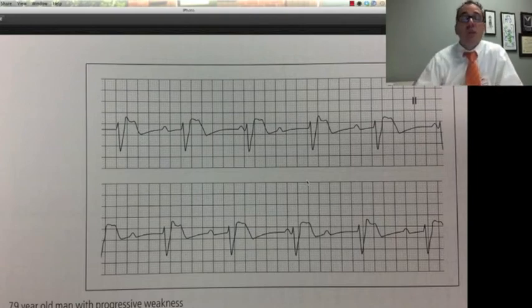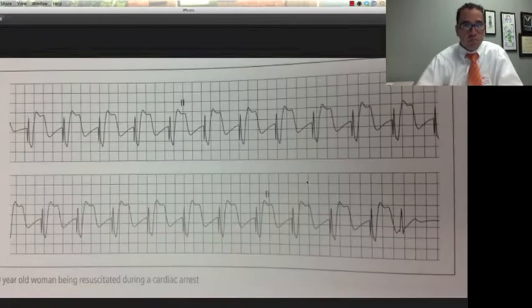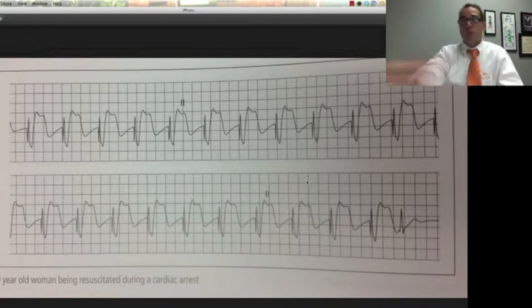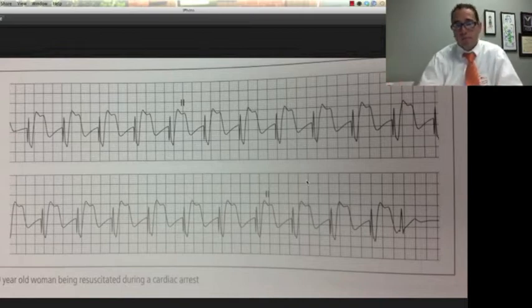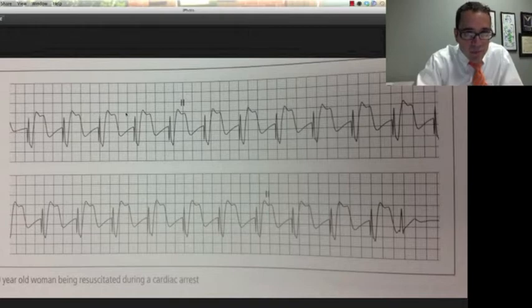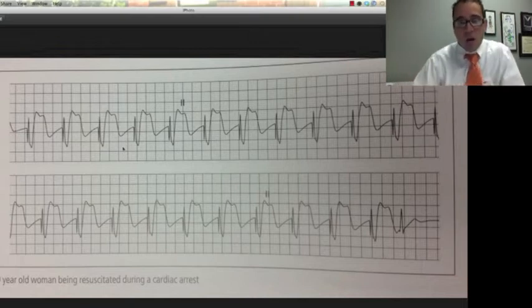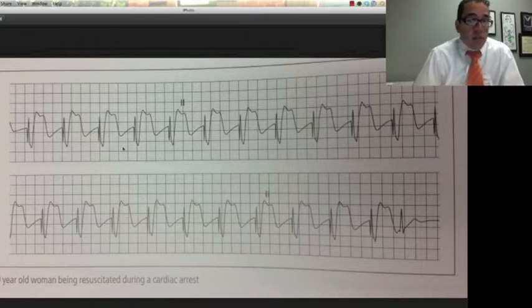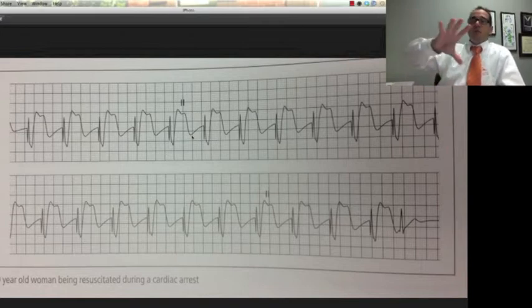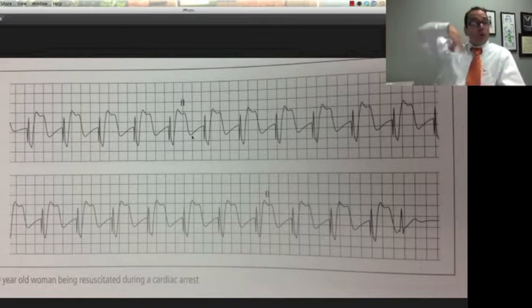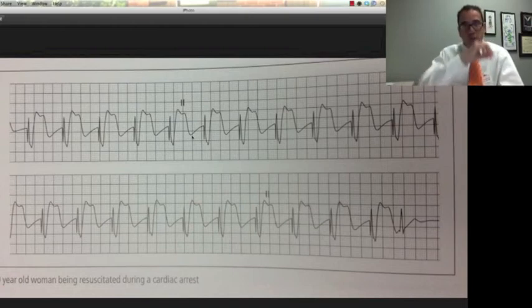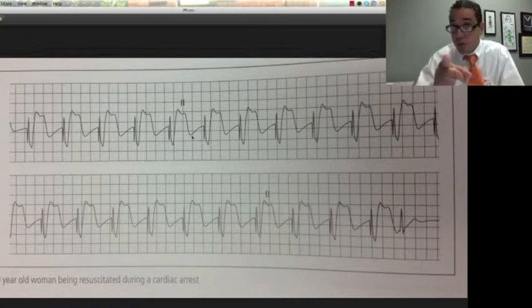So it's complete AV dissociation, and this patient is going to need a pacemaker placement. This next one should be pretty easy: 59-year-old woman being resuscitated during cardiac arrest shows up with this rhythm. You can see pacer spikes — that's a paced rhythm. She had a pacemaker and because she was resuscitated, it's back up. We can't really tell anything else from this rhythm because it's being paced at the ventricle, so it's a very wide complex. You could shut the pacer off by putting a magnet over the chest to see the underlying electrical conduction, but be careful because that might be the only thing keeping that patient alive.